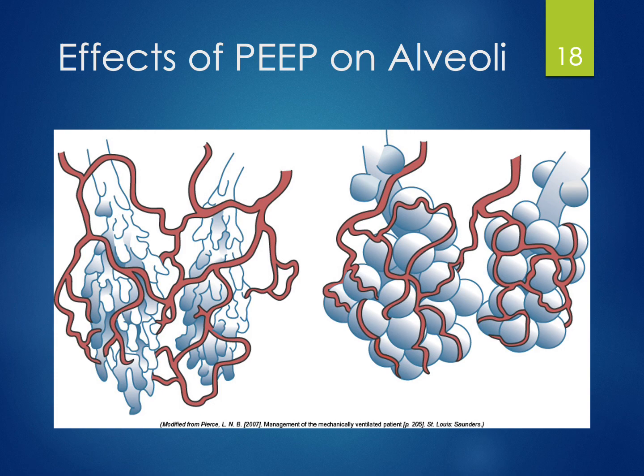Now, another thing to look at here, how close are the alveoli to the vasculature? So comparing the slide on the left to the slide on the right, PEEP is also important because it essentially pushes our alveoli closer to that ever so important blood supply to exchange gases. Remember, that's why we're breathing in the first place, is we need to communicate with the blood flow. The alveoli and the bloodstream need to have contact to exchange oxygen and carbon dioxide.